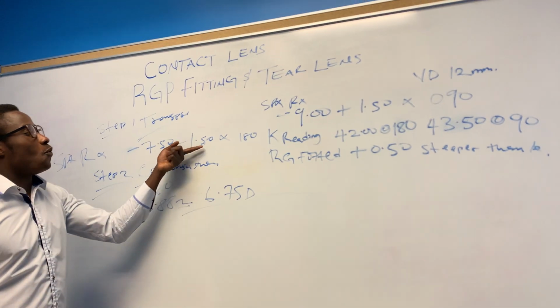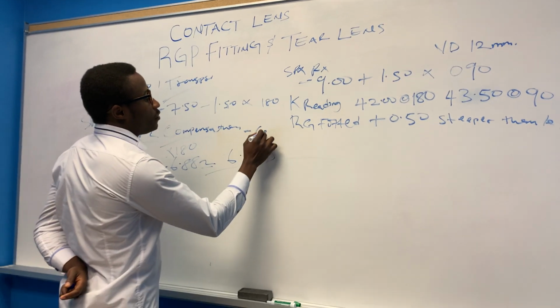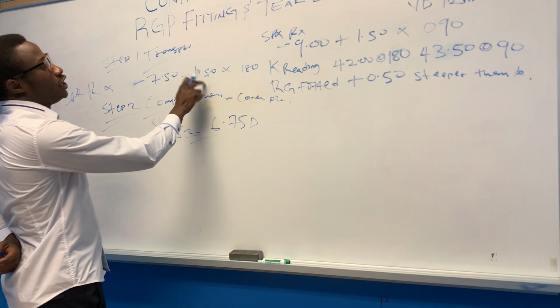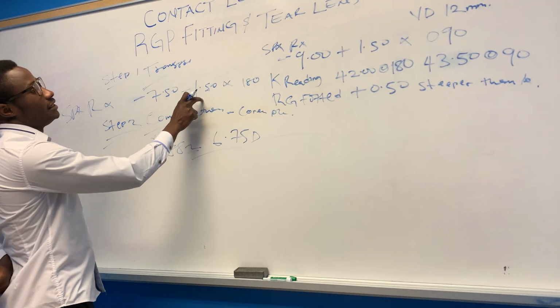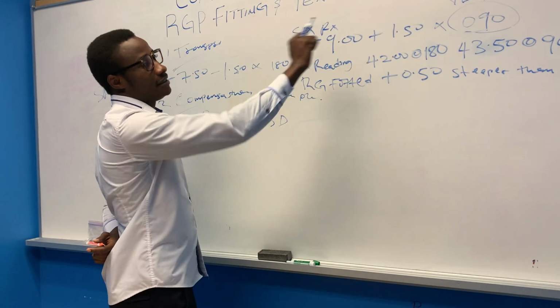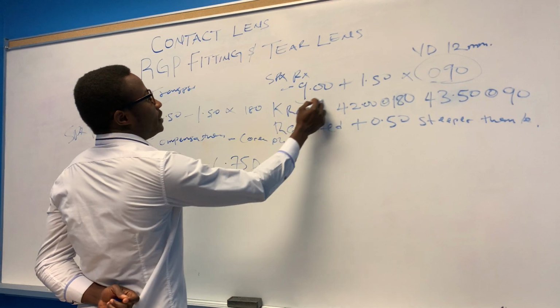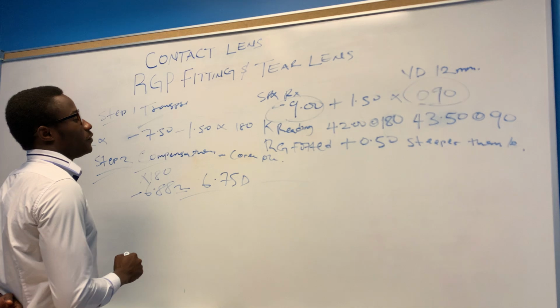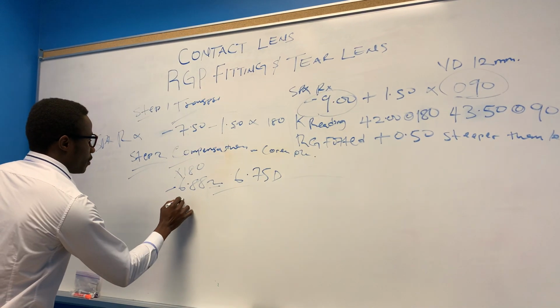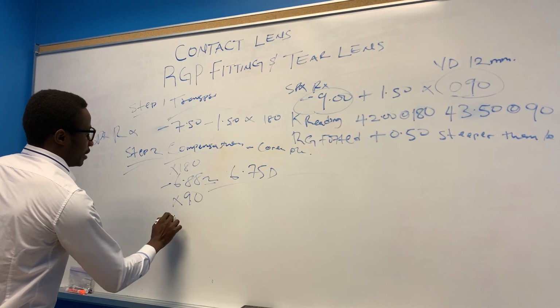So I compensate the Rx in the minus 9 meridian at axis 90.